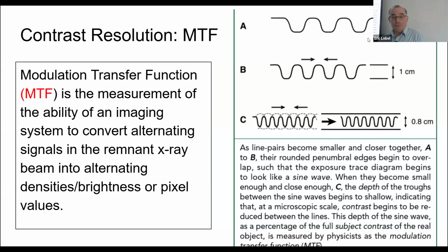Yes. So you're trying to say that if the focal spot is, say, 1, and then the DEL is 1. The example is, you can be limited by the size of the focal spot, or the size of the pixel, or both. So if the object is smaller than either the dimensions of the pixel or how big the focal spot is, you will not be able to visualize it, even if the spatial frequency of the system says that you can.